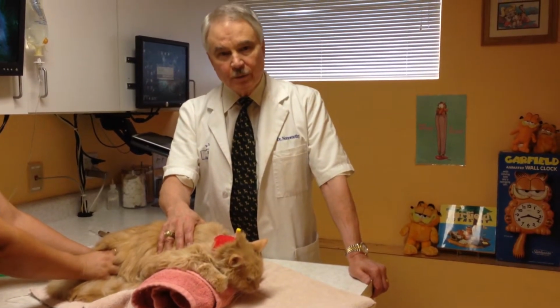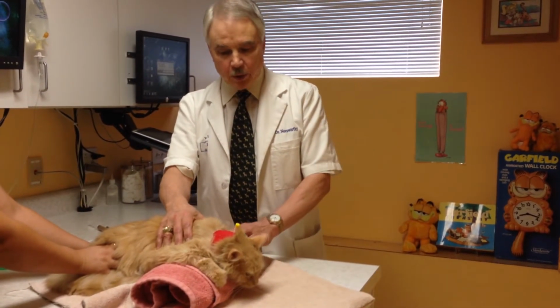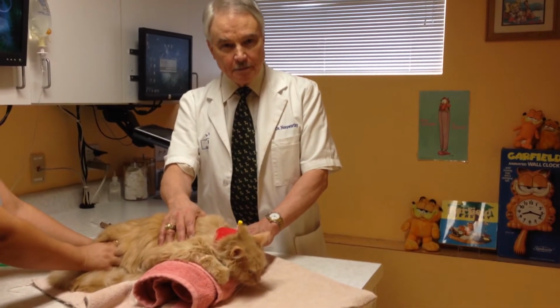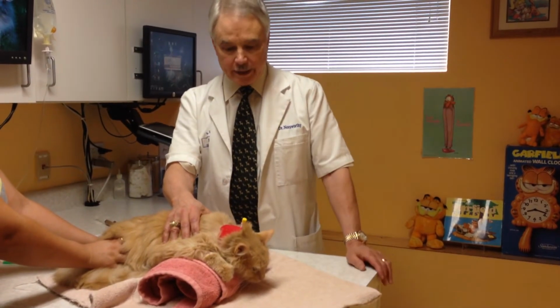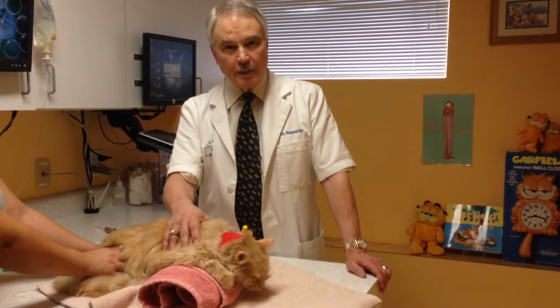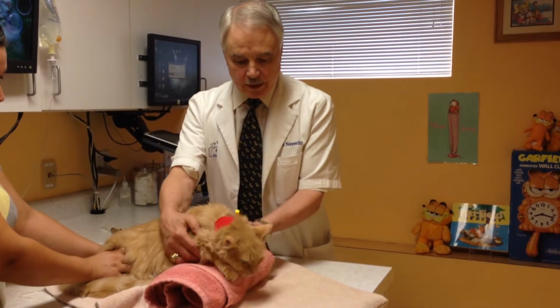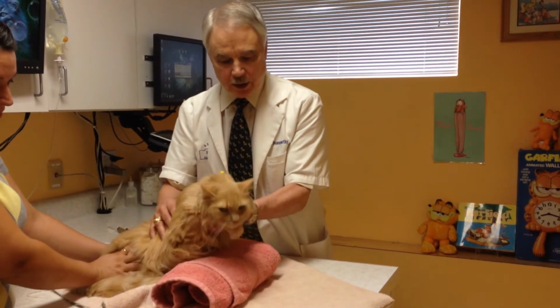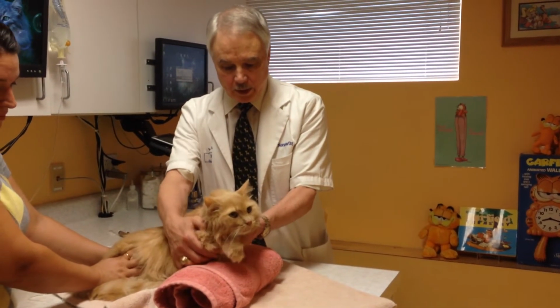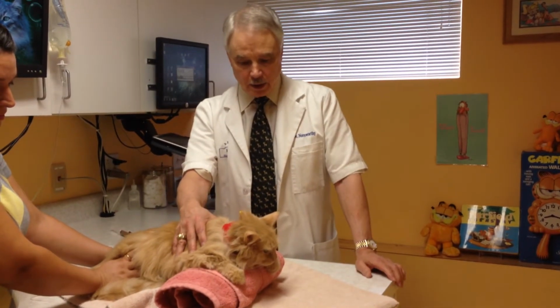So we're going to do several things to keep that from happening. The first thing is that we're going to have the cat's front end elevated. Now there are several ways to do that. You can do it as we show here with the cat's front end resting on a bath towel, or you can put the cat's front feet in your hand and just lift it up. But we want it to be approximately a 30 to 40 degree angle on the elevation.